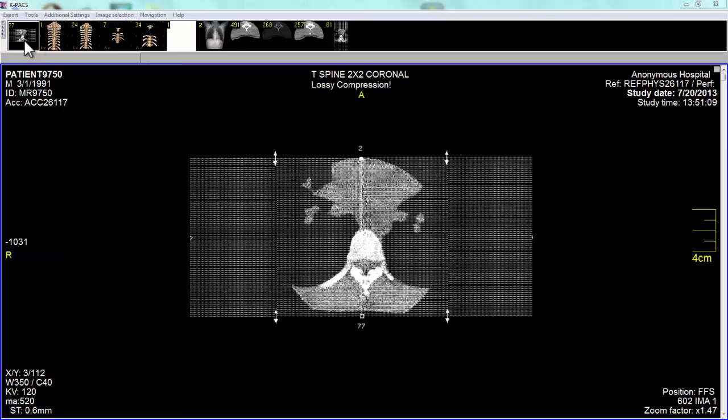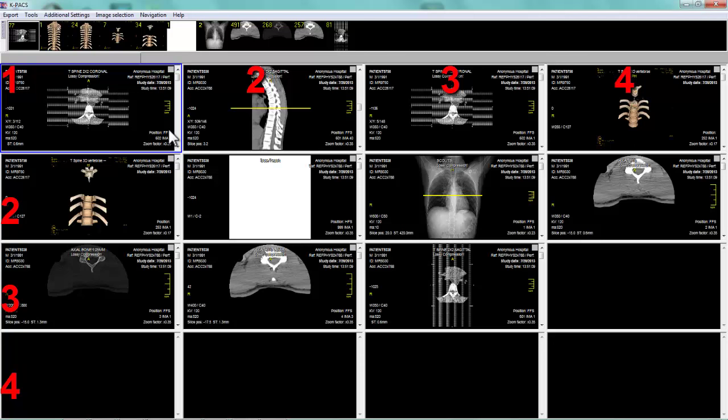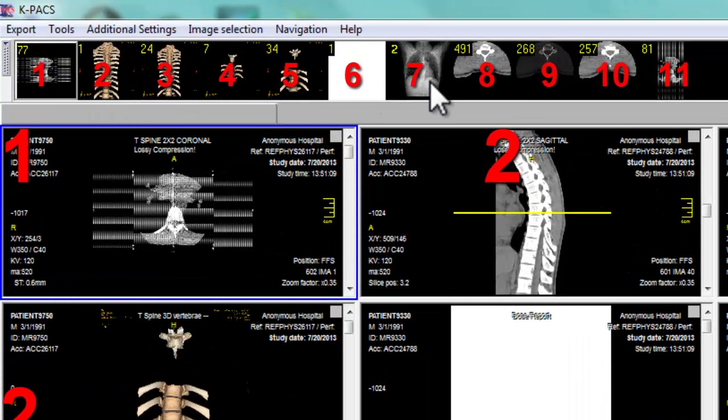We can go from one image to the maximum of sixteen images in a matrix of four by four. In this screen, we're actually looking at all eleven stacks that I could pick from at the top of my screen.